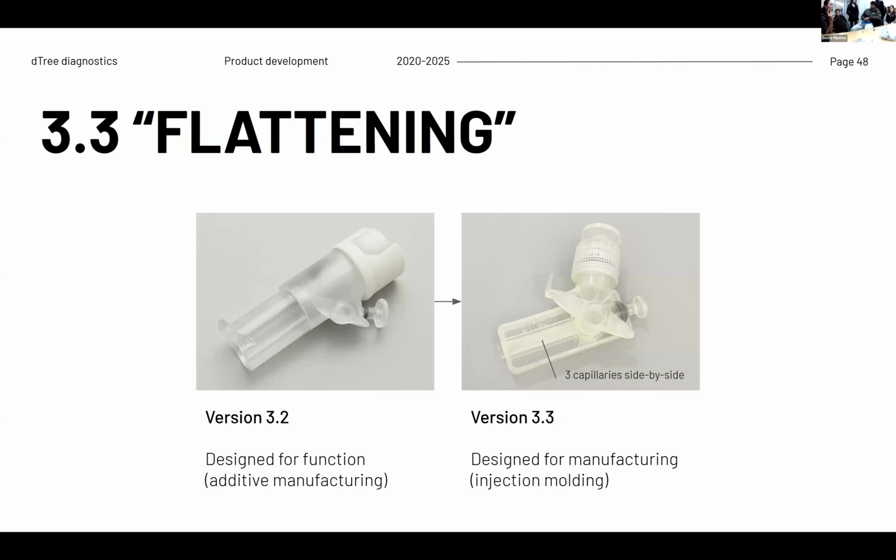If we want to completely multiplex, we can either do two of the same one, which we're doing here, and then two of the same one across the other side, so that even if they jump to each other, it's just like multiplying the reagents by 2. But we do store it in the capillary.